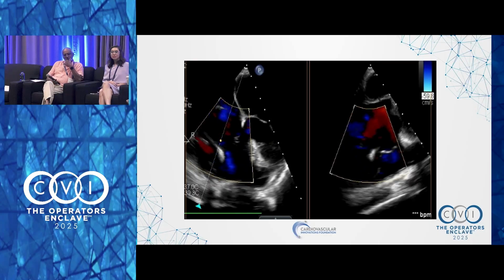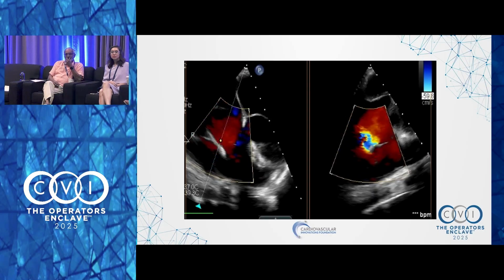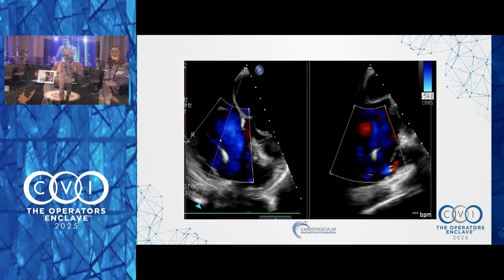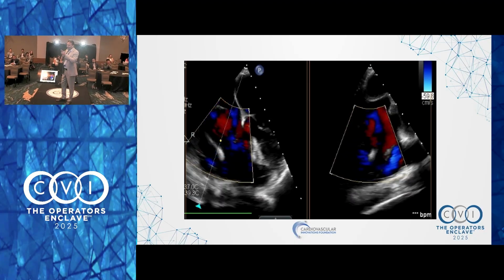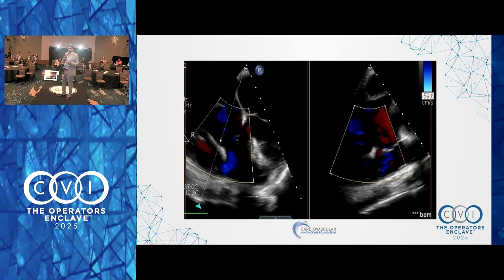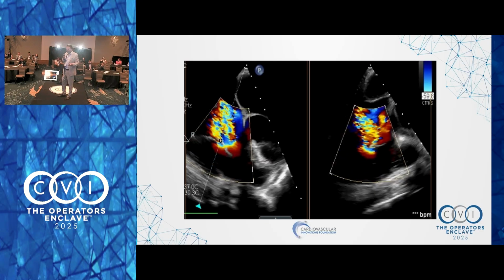Well, I'll let Hursh talk about his paper on leads and the results with TriClip. But maybe you want to finish your case, Hursh, and just tell us what you did. Let me ask you one question though, Paul, about this. Firas, you made an awesome point. We now learn that taking out the lead, I used to make this comment in conferences, and Saibal used to say too, part of treatment of severe TR is not a clip, but removing the lead. Because we had these anecdotal cases where it did get better, but for the most part, it doesn't get better.